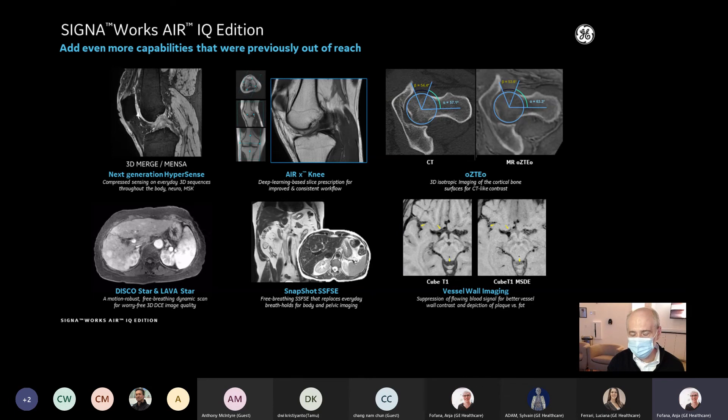There are also a lot of other features outside of orthopedic imaging. The software is really fantastic — it's got a lot of great features in it, and we're really excited to share that with you today.